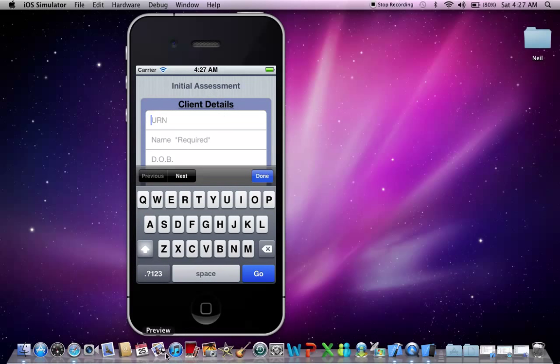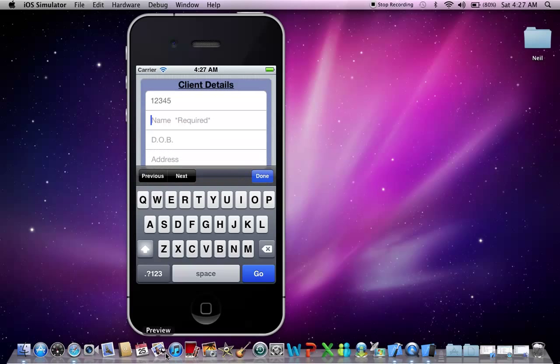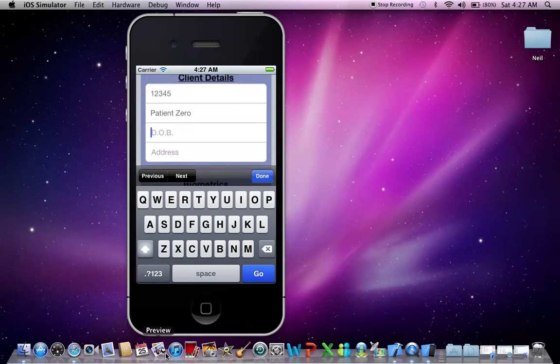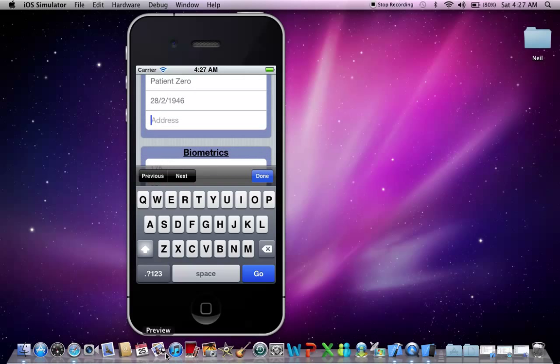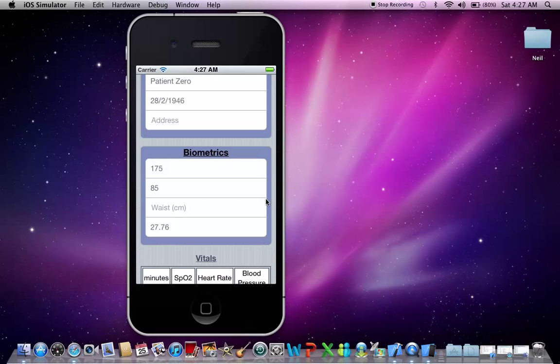Now if you're concerned about client details and security, the only thing that is required for the client details is the client's name. But you can actually just put in an alias into the client's name there. Now let's put in a date of birth. We said it was the 28th of February, 1946. And we can also put in an address, which I won't do for this example.